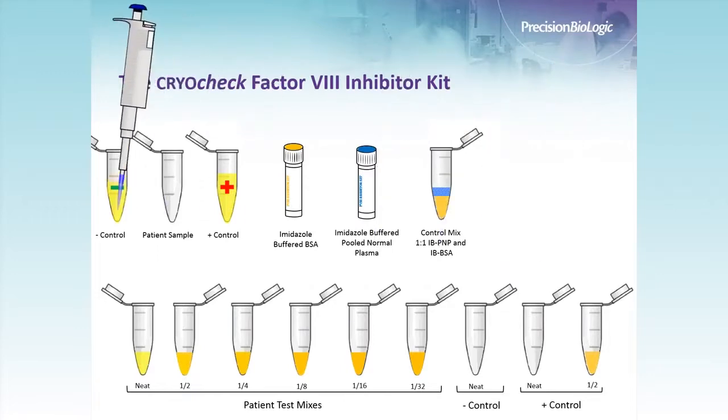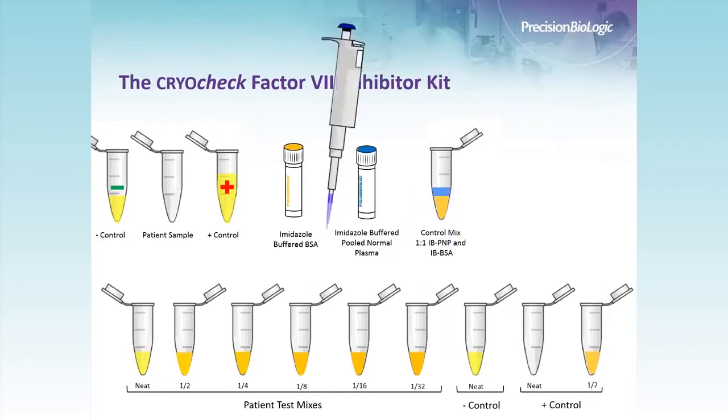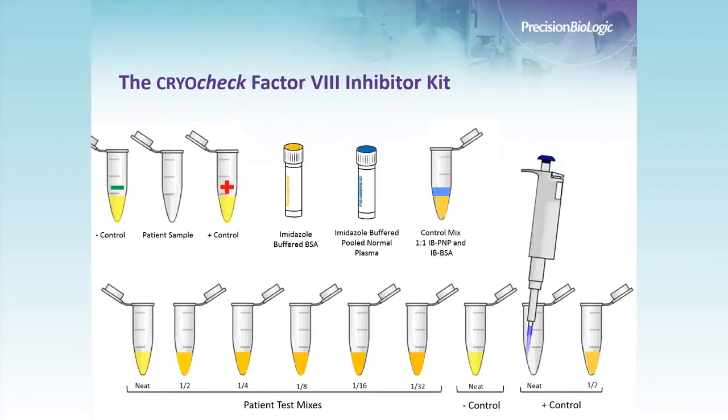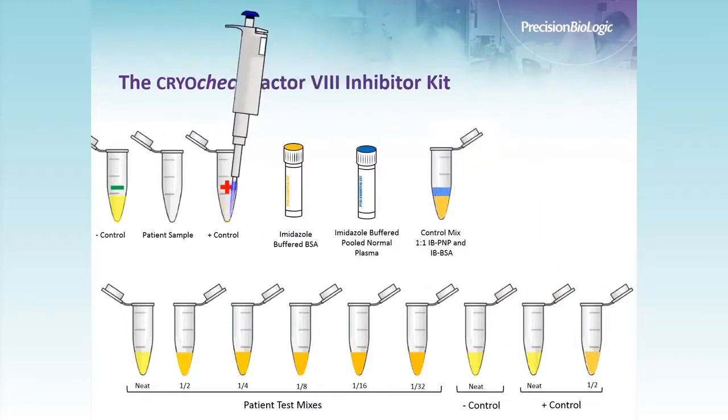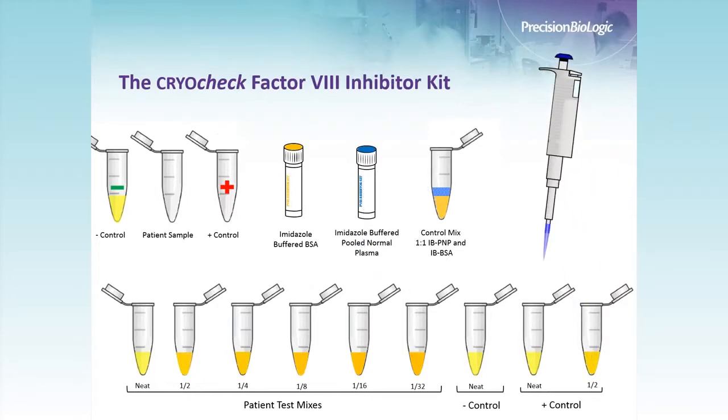We do the same for the negative control — 200 microliters into the neat vial — and for the positive control, 200 microliters into the neat vial and 200 microliters into the 1-in-2 dilution as well. When you reach your final dilution, you need to take 200 microliters back off that sample and discard it, so you always have 200 microliters of sample remaining. We now have a panel of heat-inactivated test tubes with no Factor VIII present.